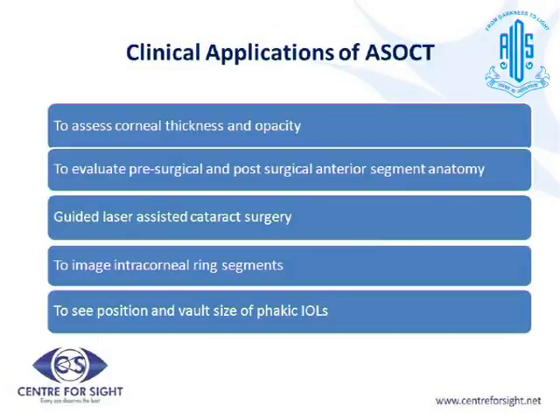So coming on to the clinical applications of OCT, it is used for a wide variety of corneal and anterior segment disorders. So I'll cover all one by one.